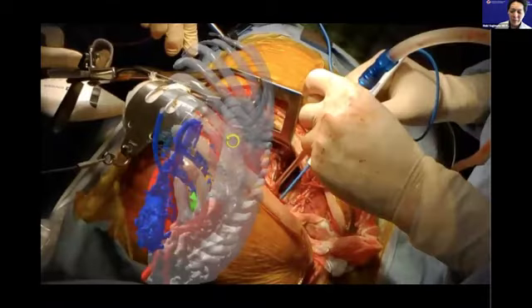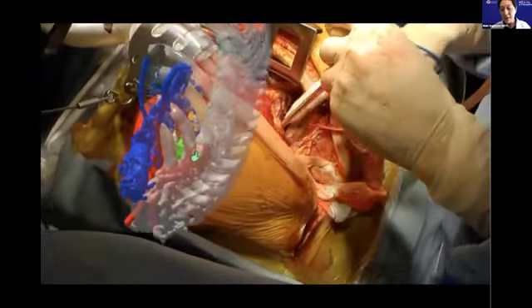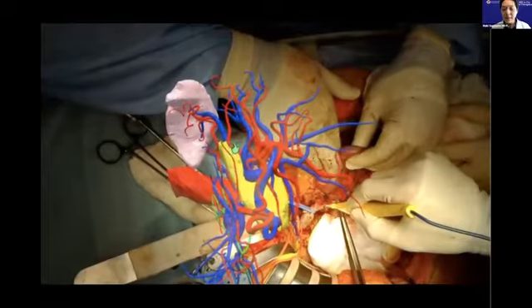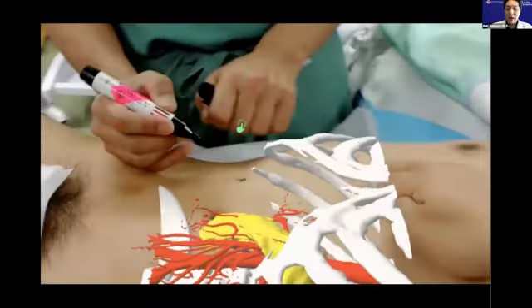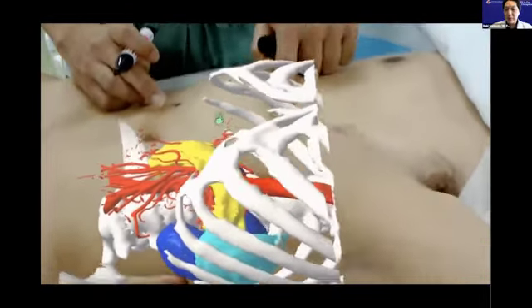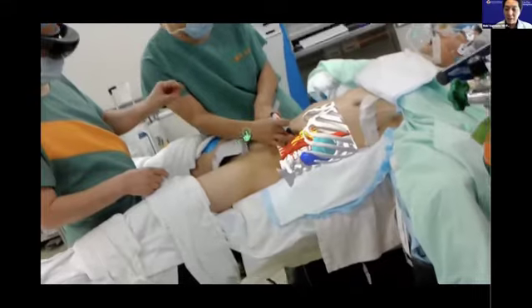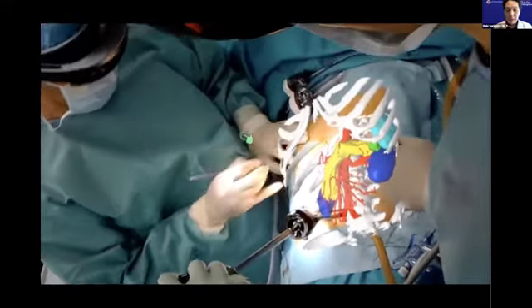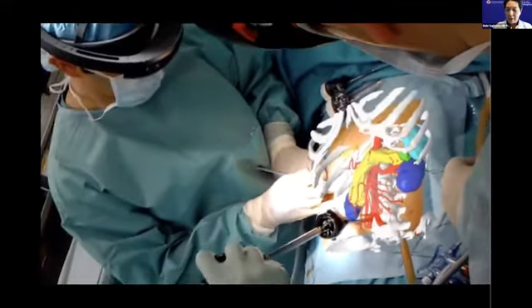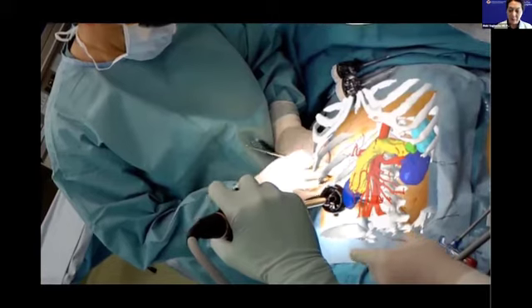It is very useful for guiding open surgery like esophagus cancer and pancreatic cancer. But for a laparoscopic surgery, you cannot see the anatomy with your own naked eye. But if you put the ports, you can select the correct area of the abdominal wall to put this holographic data onto a patient's body. Using the RGB camera and the spatial sensors, you can calculate the correct location of the patient and the holograms. You can match it onto the actual environment.